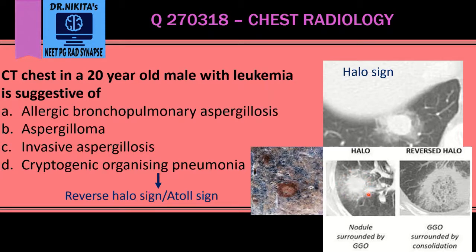To differentiate ground glass from consolidation: in ground glass, as seen in the surrounding halo, we can see the underlying pulmonary vessels, while in consolidation it is very dense and obscures the blood vessels. So to summarize: the reverse halo sign or atoll sign indicates cryptogenic organizing pneumonia, while the halo sign indicates angio-invasive aspergillosis.